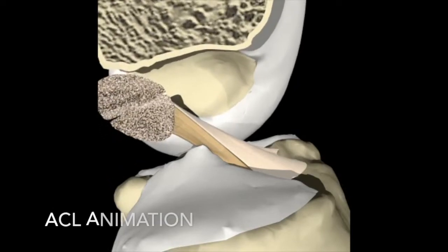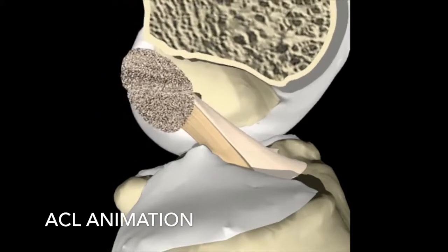This is Dr. Clayton Lane. I wanted to show my patients what their ACL reconstruction looks like at six months.